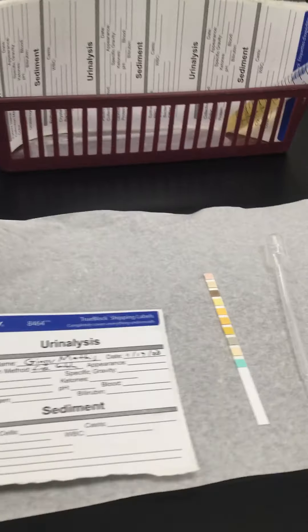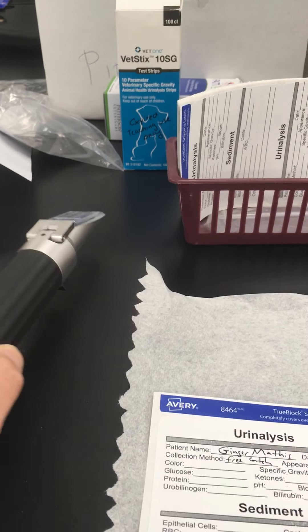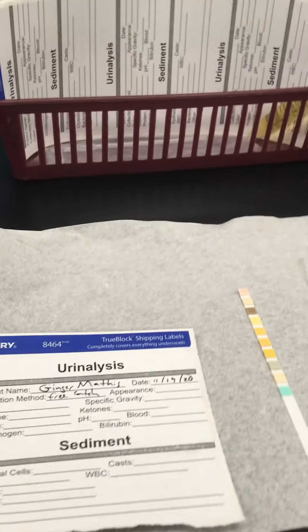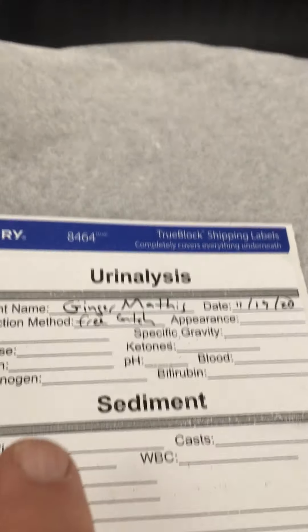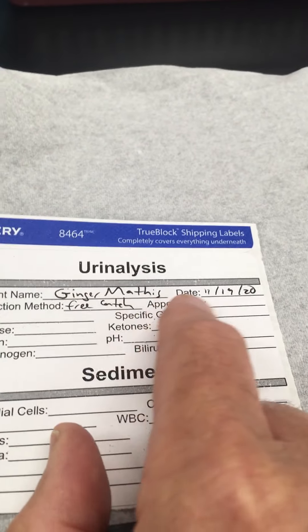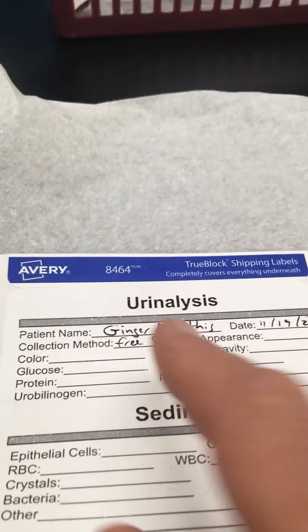I was just going to show you what you can do. Ideally you would have a refractometer, but obviously that would not fit in an envelope, so we'll just have to pretend there. I've gone ahead and collected a urine sample from Ginger here, and I've written on the form the sticker, her name, the date, and how I got it — free catch.